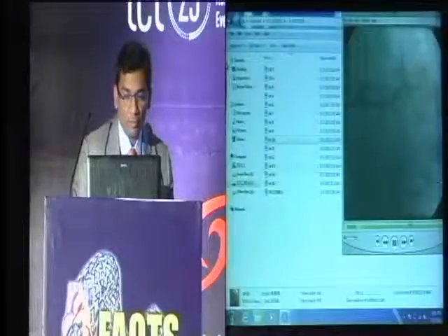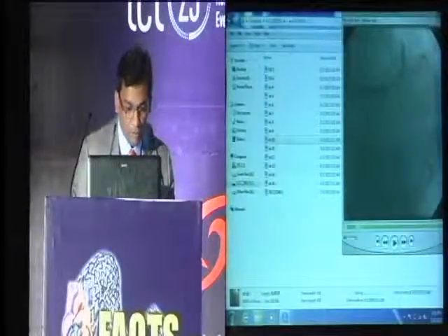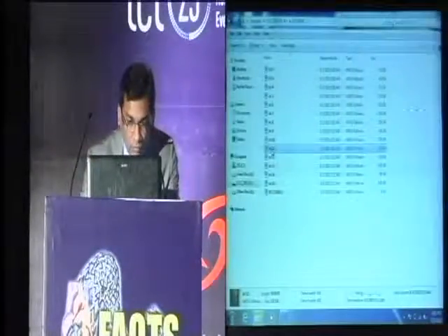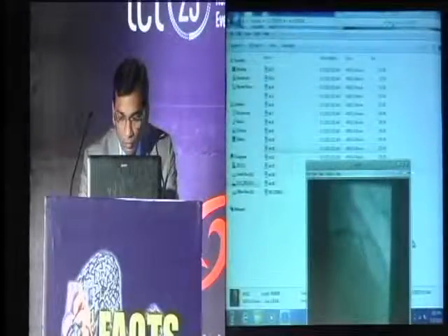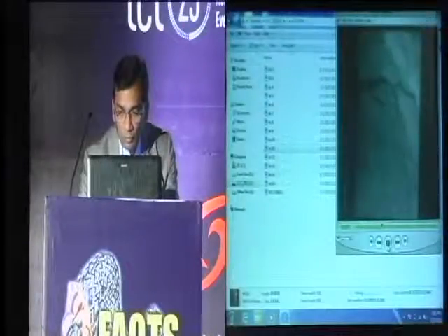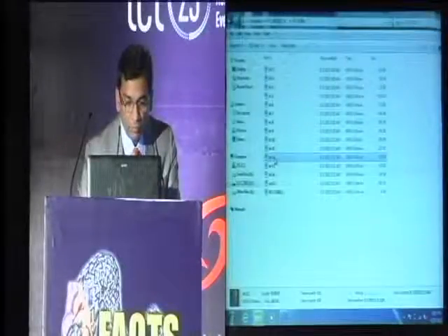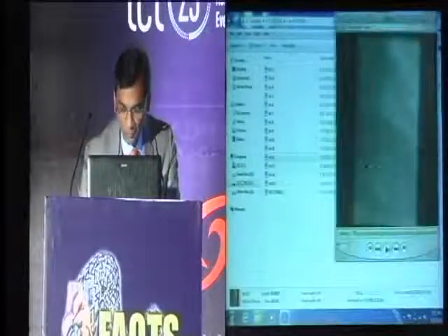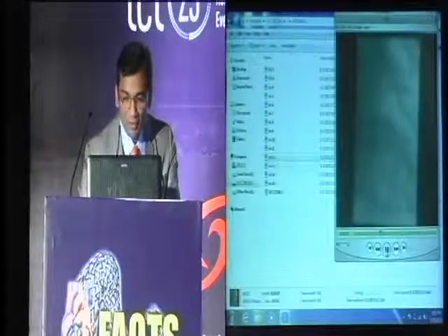This is a more splayed view to look at the bifurcation. Sorry, I had to do this in a single clip at a time.